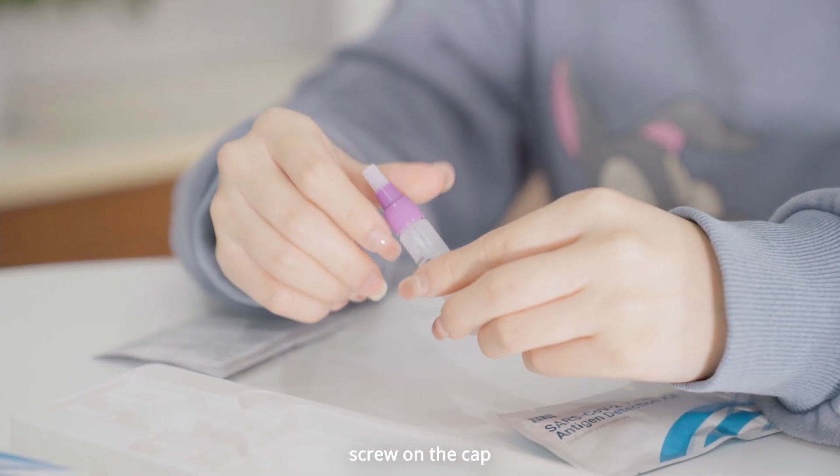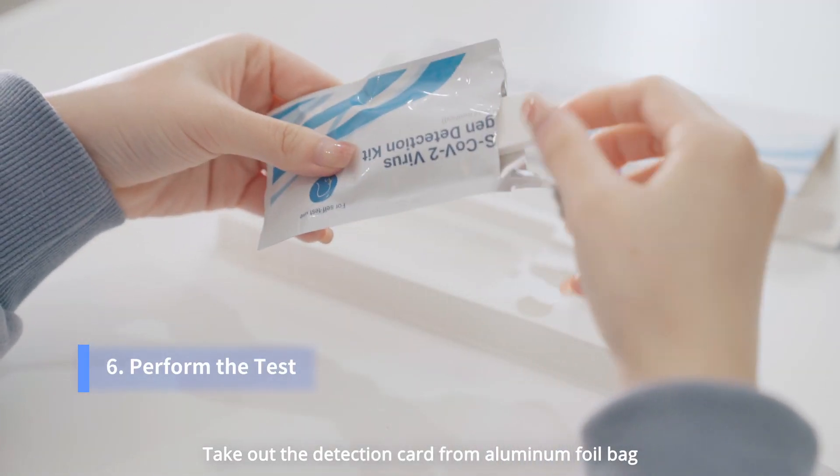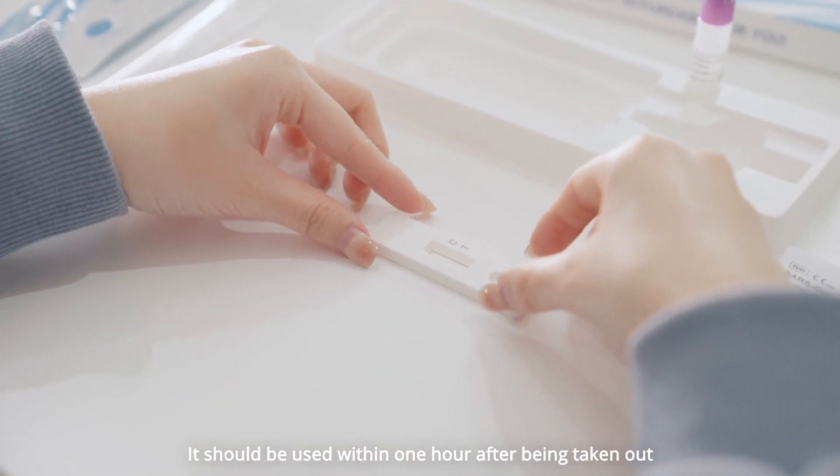Break the swab stick at the breaking point. Screw on the cap. Put the tube on the tube base. Take out the detection card from the aluminum foil pouch. It should be used within 1 hour after being taken out.